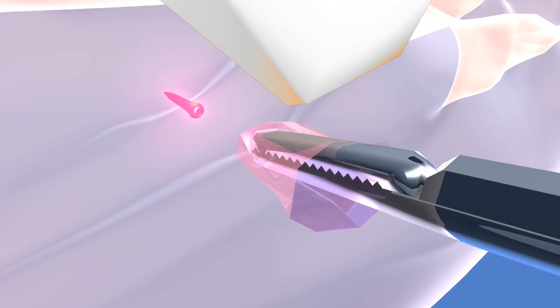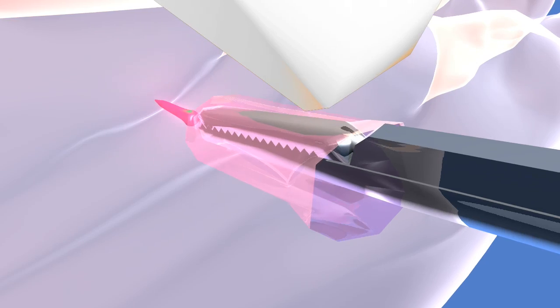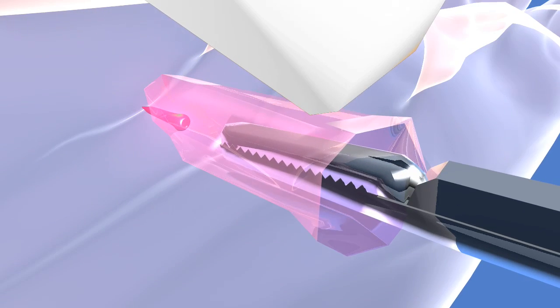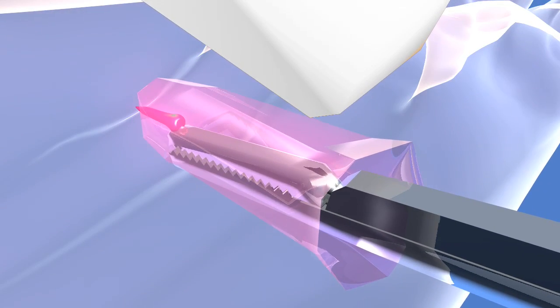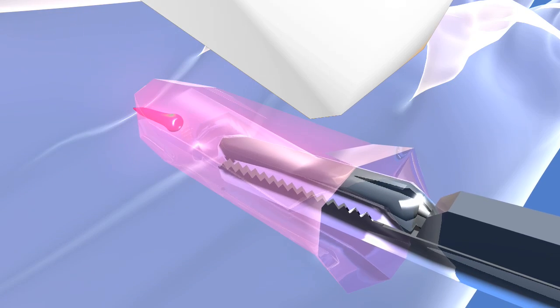The forceps are then used to not only make the blunt dissection pockets, but also to grasp the foreign body at the end of the foreign body, avoiding the possibility of fragmentation of the foreign body during removal.